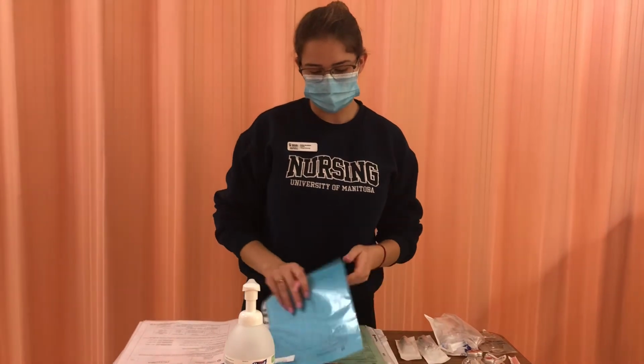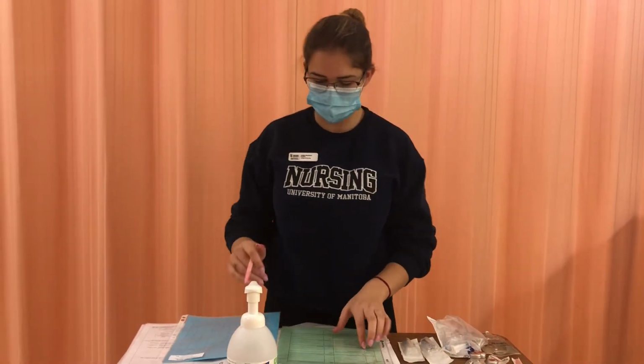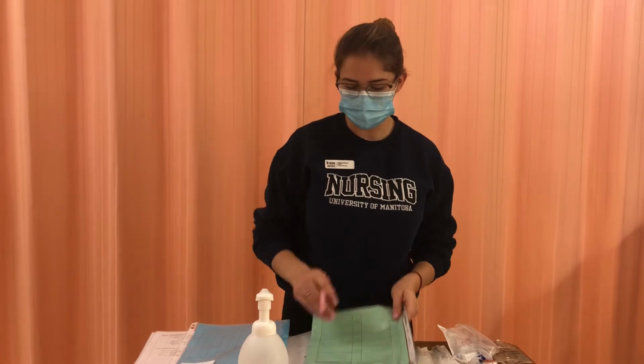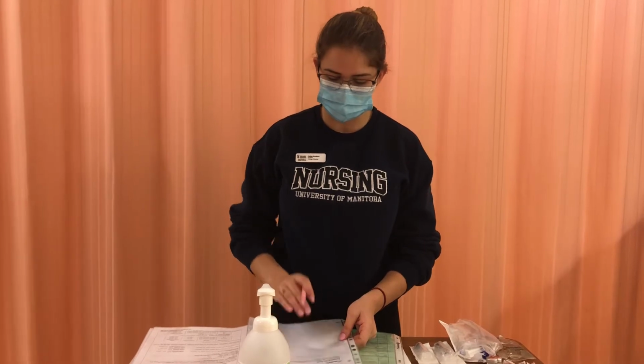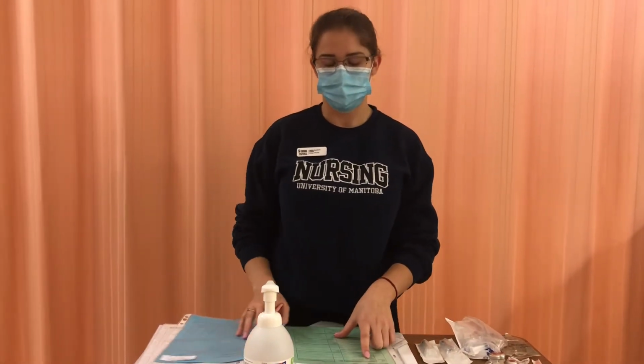Today I'm going to be demonstrating an IV intermittent drug administration via mini bag. First I'd be checking over my physician's orders and making sure that everything matches on my MAR for my drug. I'm checking over my patient's chart, and I've found that my patient, Emma Wrightson, has come in with an infection from a cat scratch, so she has cellulitis on the left arm. This drug, cloxacillin, is indicated for that condition.